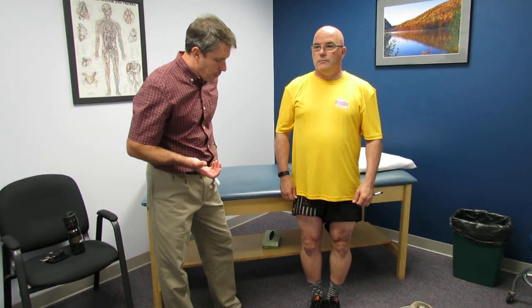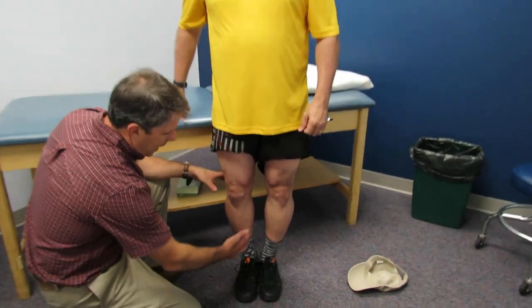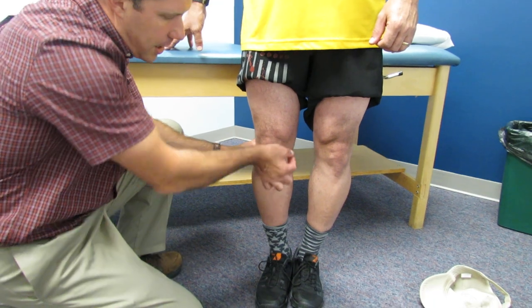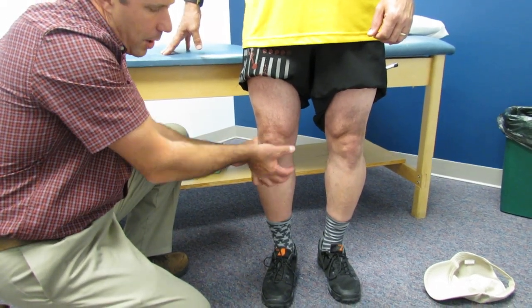He was just measured for the brace. The idea is to get three points of contact: one down here, one up here, and then the third one pushing the knee more into a neutral position and opening up the medial joint, so he can take the load off.